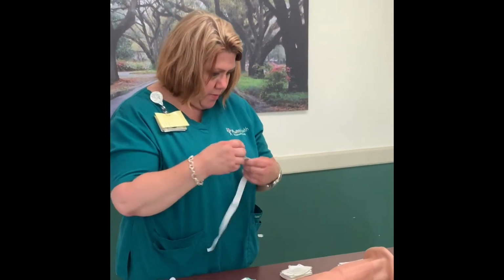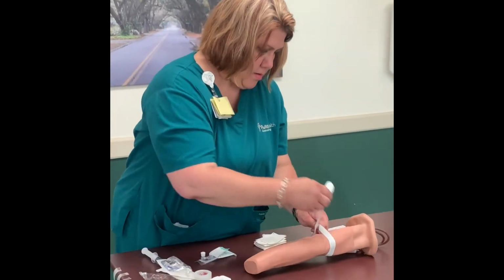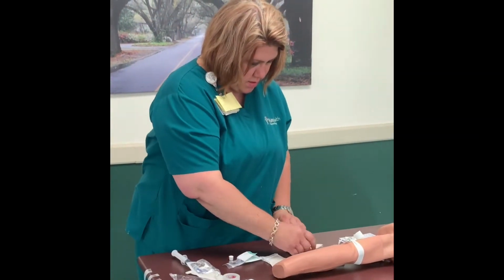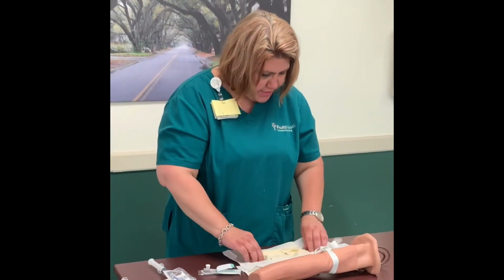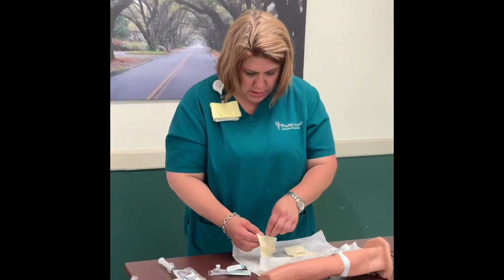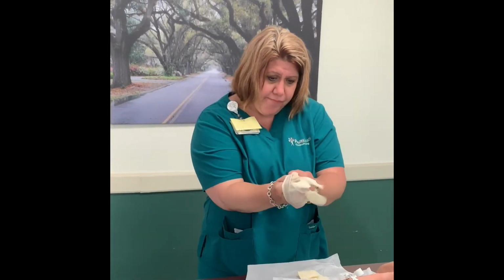I'm going to go ahead and apply my tourniquet. Put on sterile gloves. Again, this is something that your nursing students will do 100 times before you get out of nursing school.